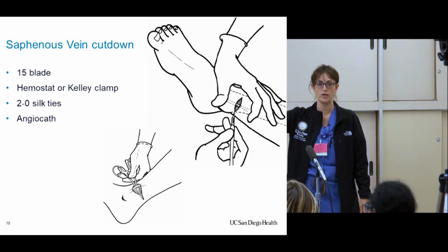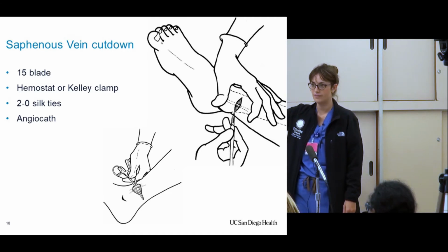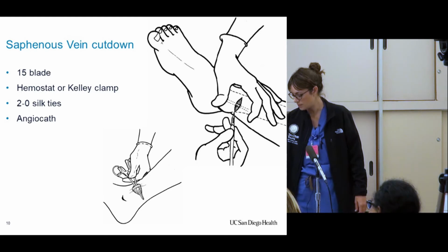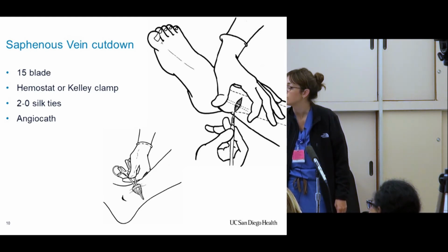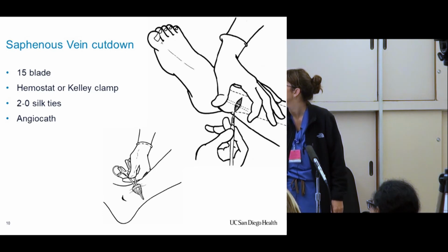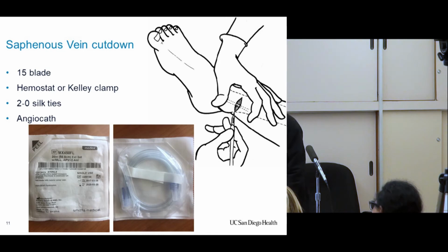Instead of busting open one of these trays, you don't necessarily need to do that. Just hand them a lac tray. They'll be fine. And a knife. Sometimes they'll ask for some retraction, especially if someone is obese and has a lot of adipose tissue there. Then you might use something else. I'll come back to that in a second.